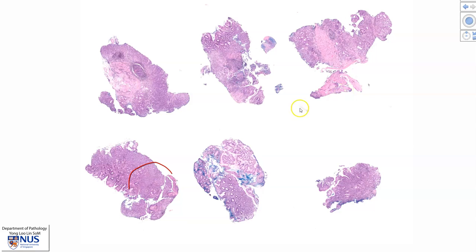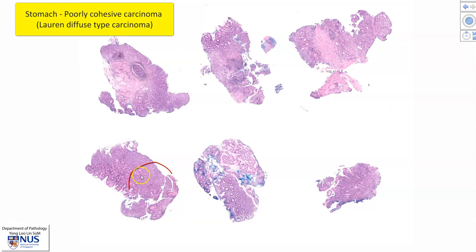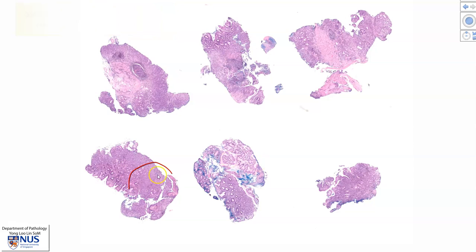Hello, this is a virtual microscopy slide of a case of gastric poorly cohesive carcinoma, or Lauren diffuse carcinoma, and this is taken from an endoscopic biopsy.